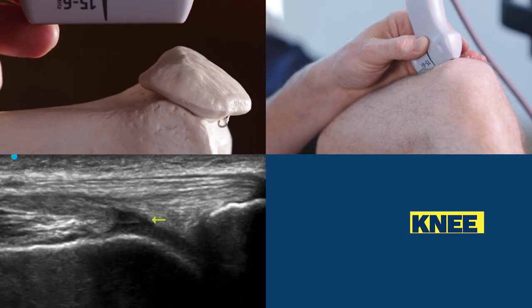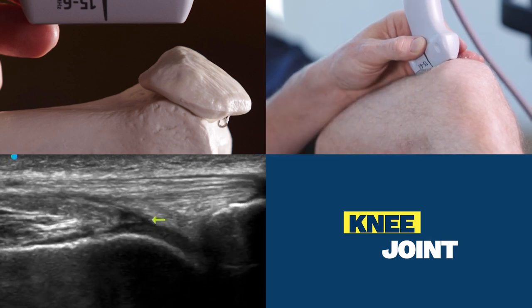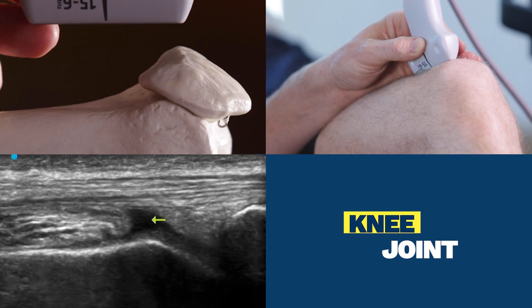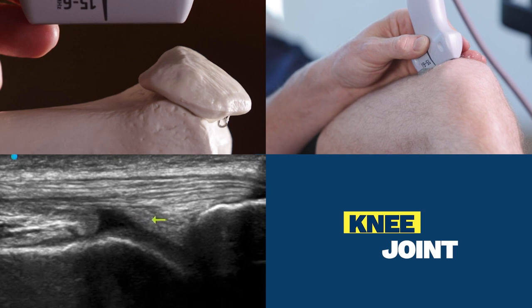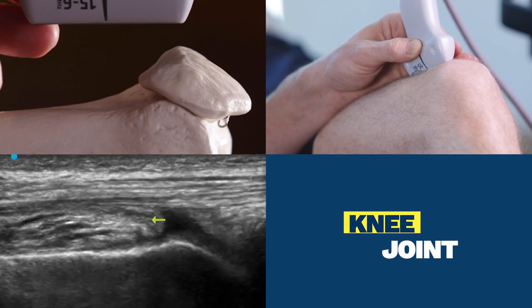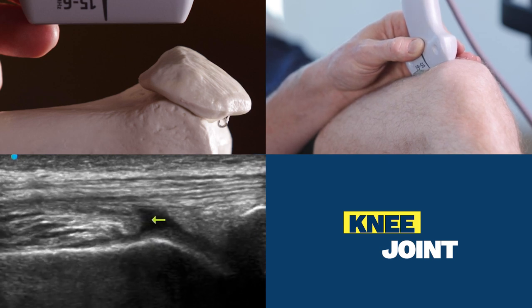My landmark is going to be the patella — you can see that on the top right view of the screen. The orientation of the probe is long axis on the femur. My area of interest is in the center of the screen highlighted by the yellow arrow, which is now over the suprapatellar fat pad, and then over the pre-femoral fat pad. So the joint fluid recess we're looking for is between the pre-femoral fat pad and the suprapatellar fat pad.